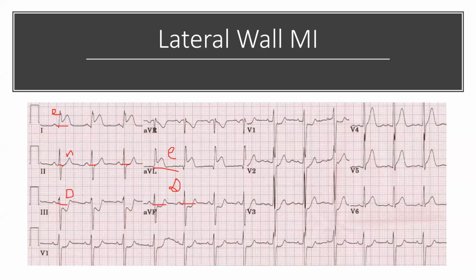And V1, depressed. V2, depressed. V3, depressed, and V4.